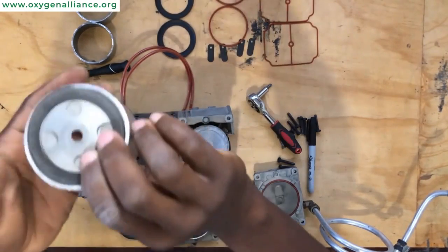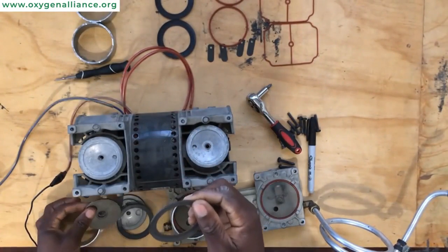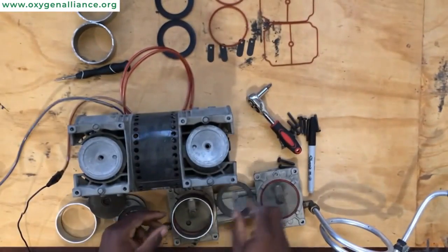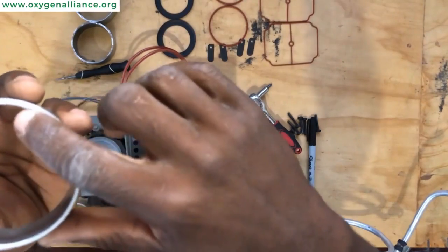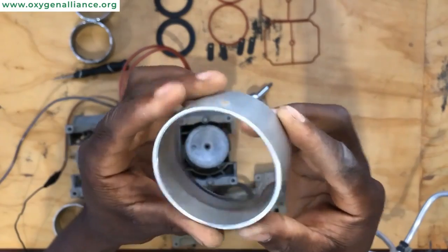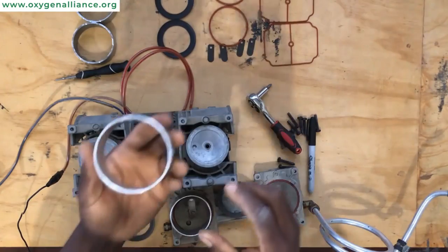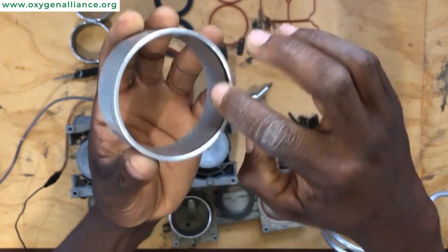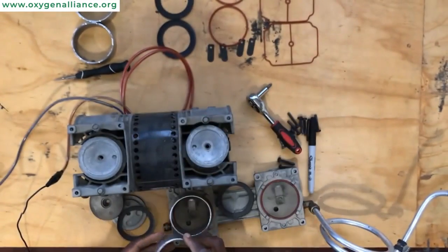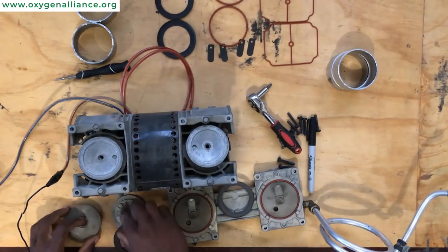On the other side it's the same thing — visible damage and the side is almost peeling off as well. If you look at the cylinder sleeve, we can also see the wear inside. Depending on how long the compressor has been running, you can see how much damage has been caused. We need to replace these components with the new components that we have.